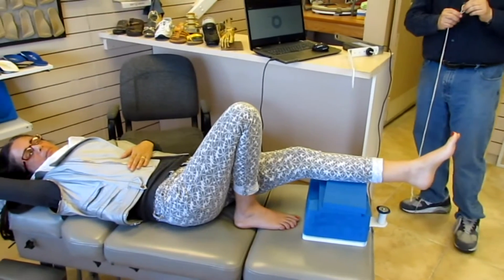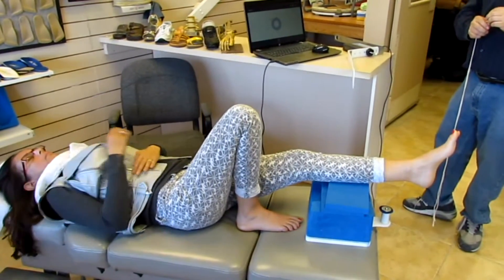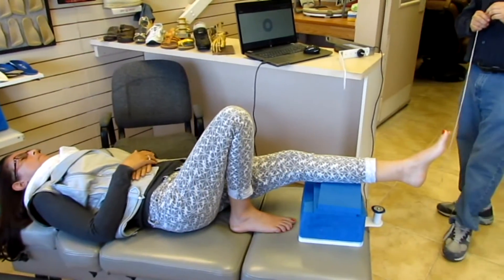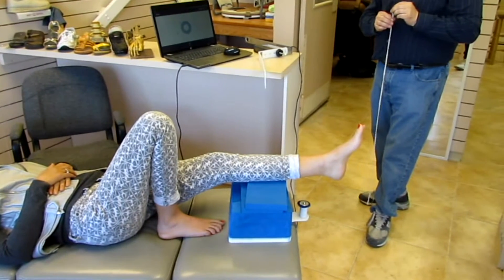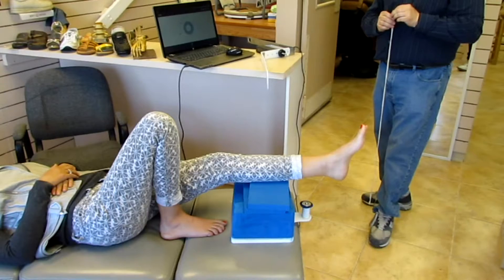Our patient is lying supine on the table. Her leg has been placed on a casting block already. The foot is extending past the edge of the table. At the bottom underneath the foot, you can see a pivot point.